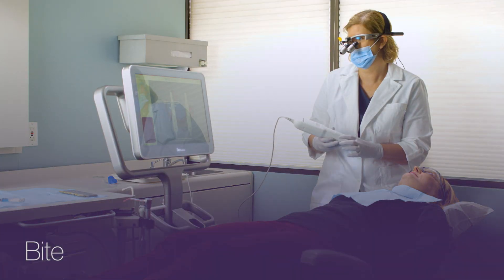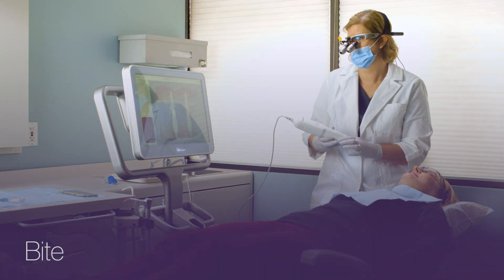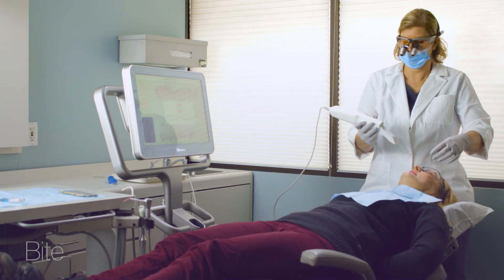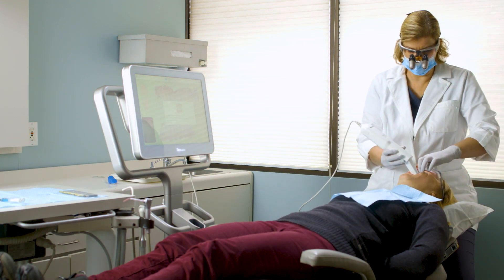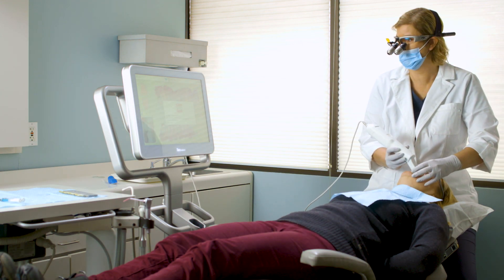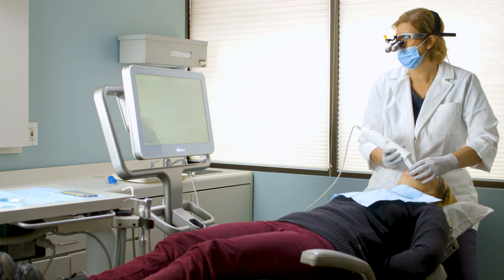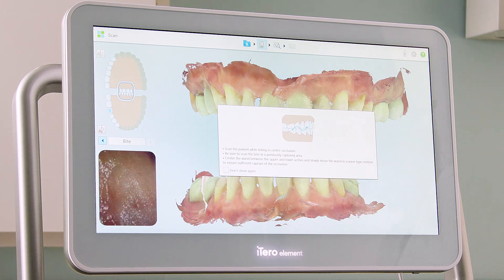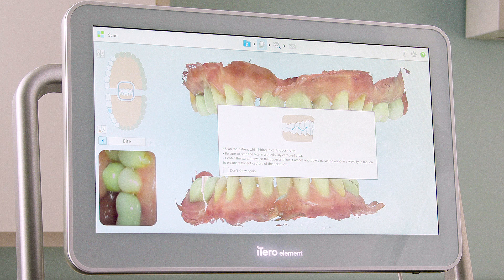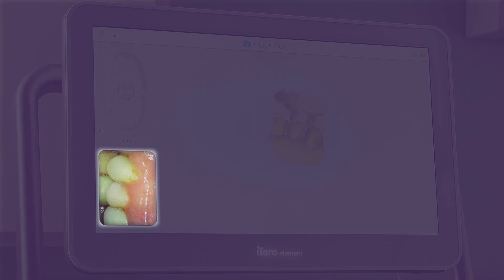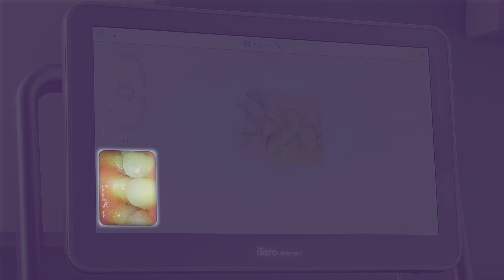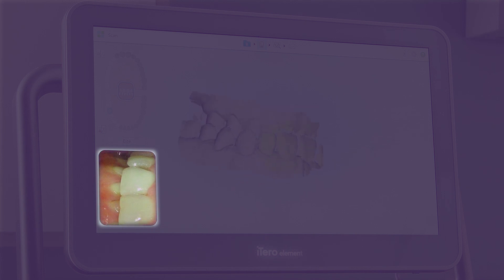The next segment is the bite. To scan the bite, I will have the patient open, retract the cheek with the wand, and have the patient close in tight centric occlusion. I will place the wand against the teeth and center the occlusion in the viewfinder. I will press the side button to start the scanner, and in a wave-like motion, move anteriorly, capturing three to four teeth and the upper and lower gingiva.